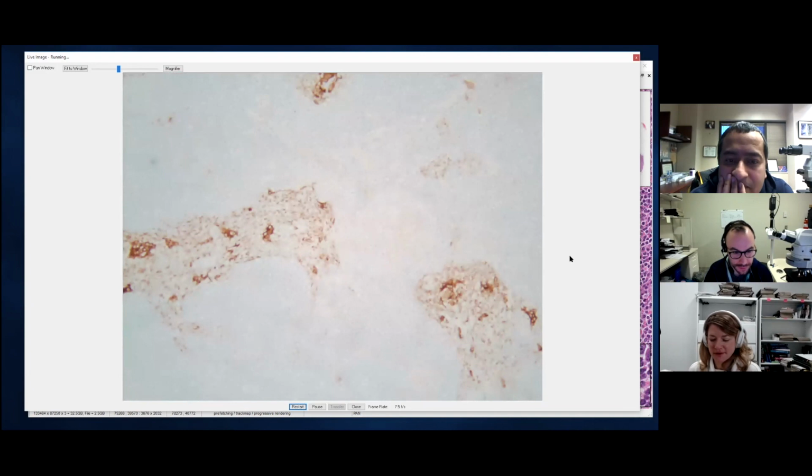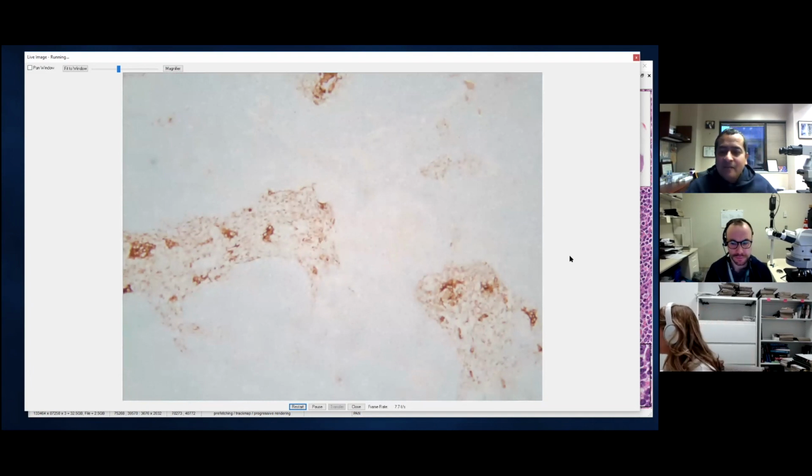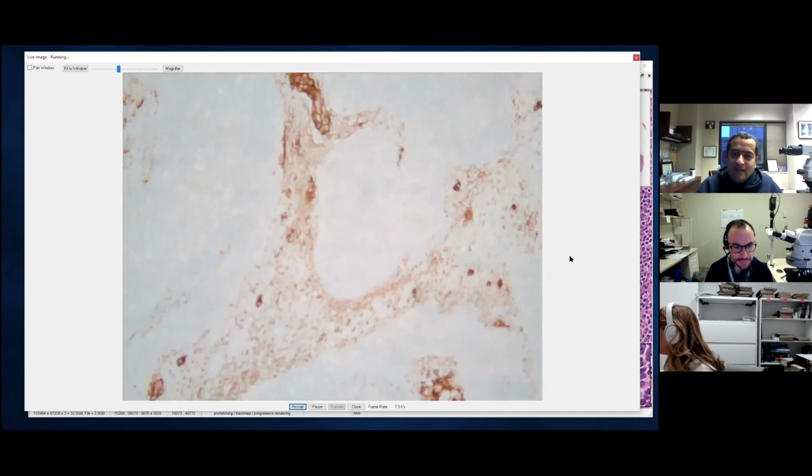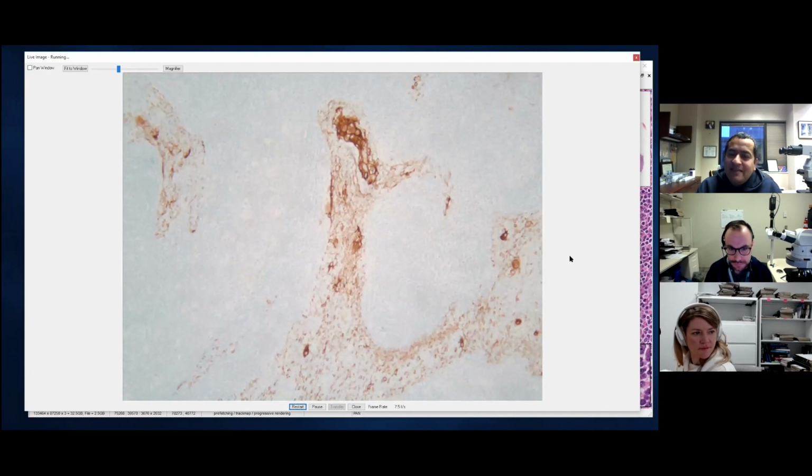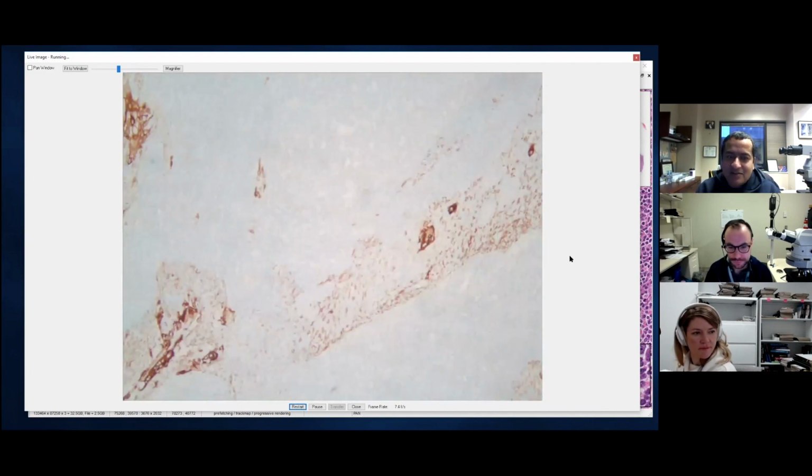Oh, that's nice. And so that's a little bit of the thymic epithelium left there, highlighted with that keratin. Yeah, so we can see maybe the epithelium is a little bit expanded here by some of the lymphoid cells. And this would also show up on the TDT stain, right? So the residual thymic tissue should show up on the TDT as well. I hope we did. I was just watching your first episode where you spoke to the virtues of doing a TDT stain, but did we actually do it?